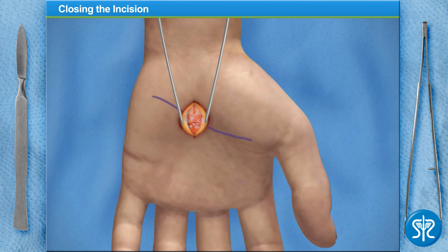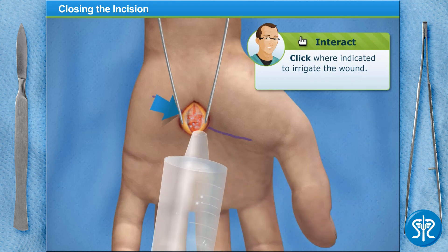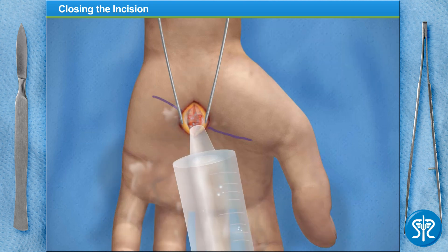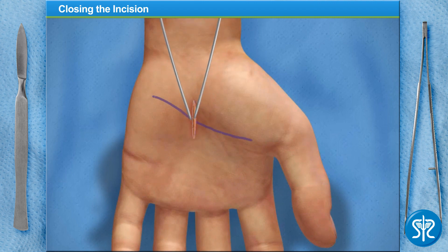Now we can begin to clean and close the incision. Go ahead and irrigate the wound. When you're finished, I'll release the tourniquet, allowing blood to flow back into the hand. Now you'll close the wound using non-absorbable sutures.